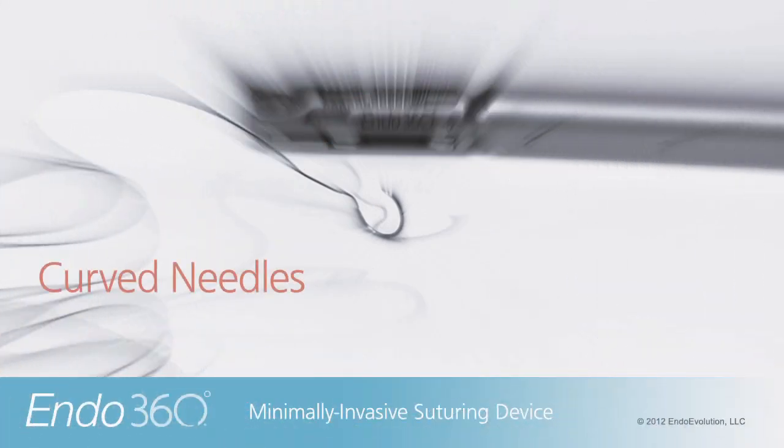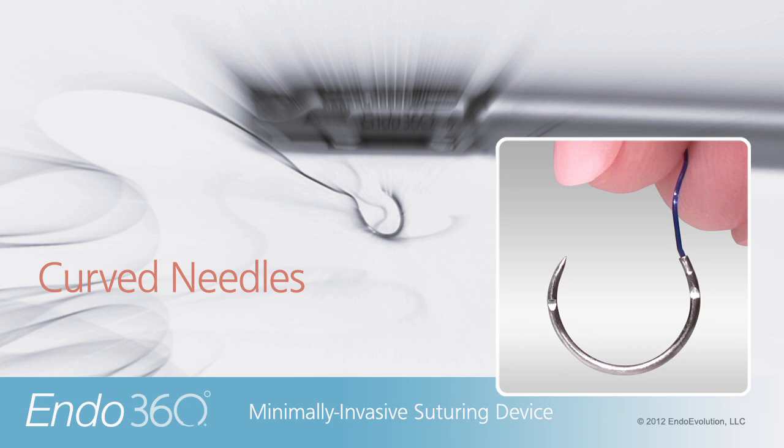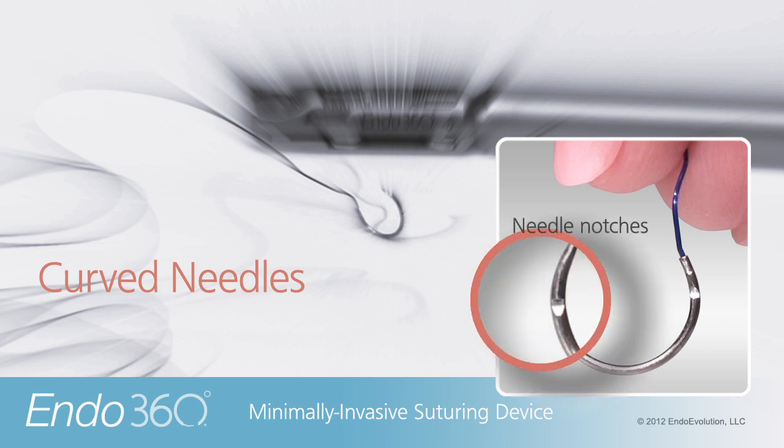The patented Endo360 needle is a standard type curved suture needle with a sharp taper point. The Endo360 needle is curved to a proprietary shape, approximately 270 degrees, and contains proprietary notch features.